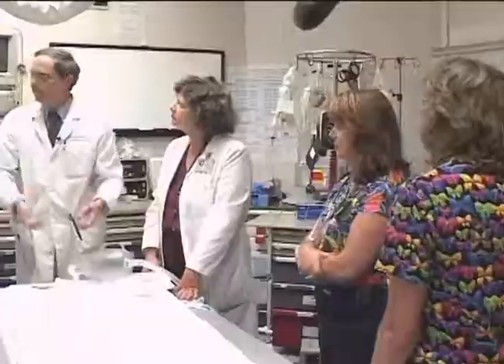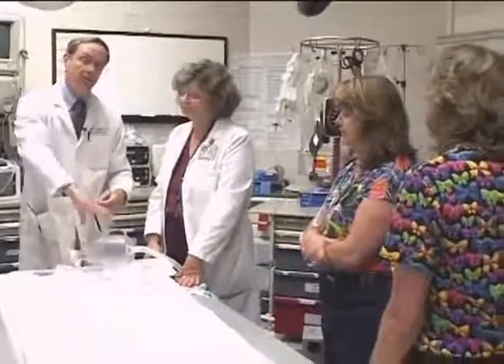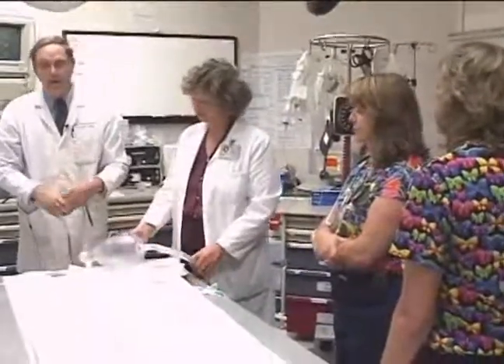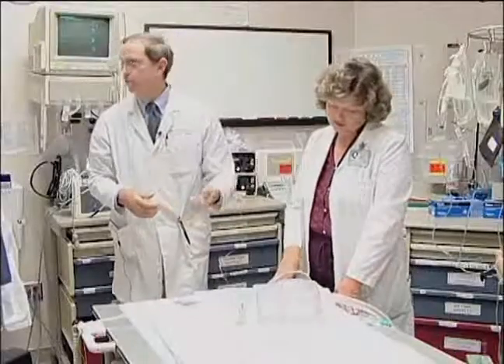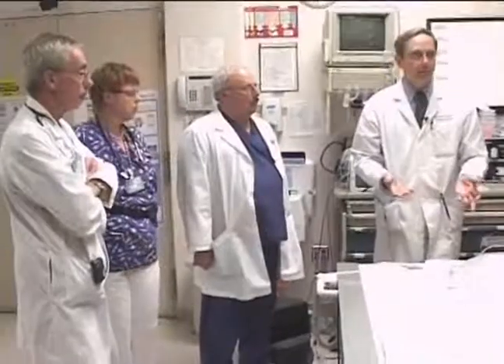But you guys really got to make sure that the tube is secured to the patient. And it's awkward because we're working around a cervical collar, and then the anterior cervical collar comes back on. And then at that point we'll just ask, do we want to continue manually bagging this patient, or can we go ahead and put him on the ventilator and then get the appropriate ventilator settings.